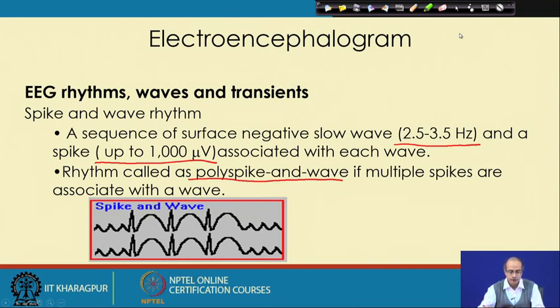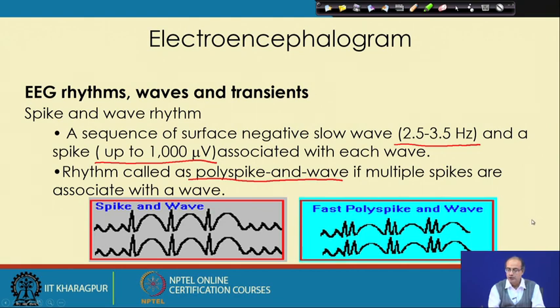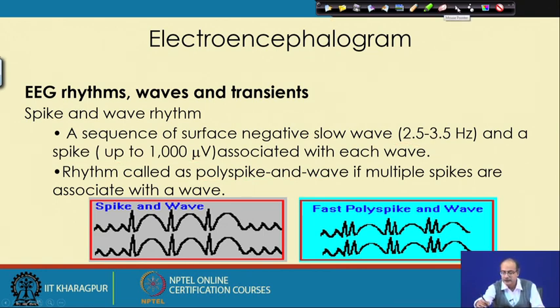that is called polyspike. So, here we get some examples of spike and wave: the spike followed by the wave, and again the same repetition is going on. In a very similar way, we can have the polyspike and wave. The spike is predominant because of its amplitude, and we cannot miss the following low frequency wave also, because it has some shape. That is why it got a separate existence, unlike the delta or theta wave. So, that makes it different from those predominant waves.